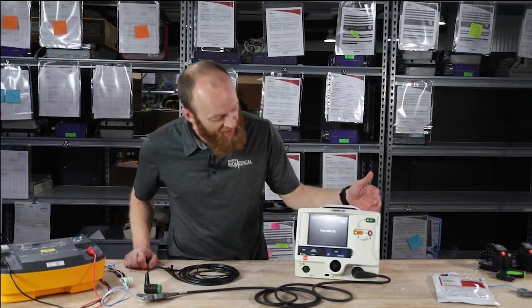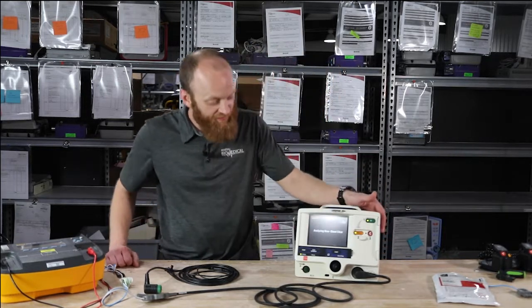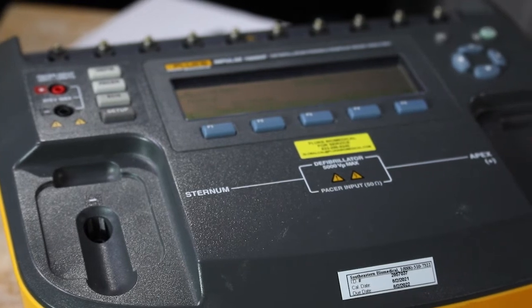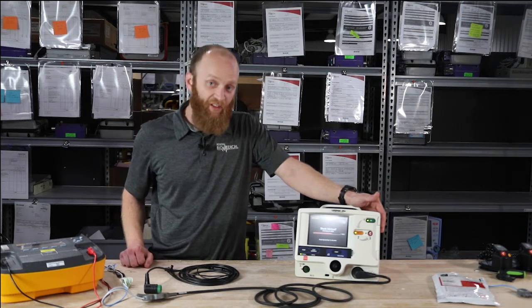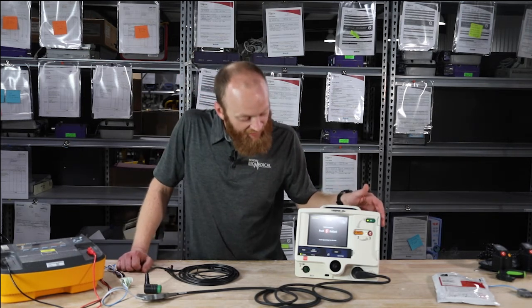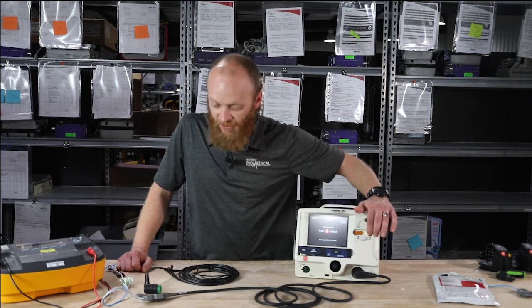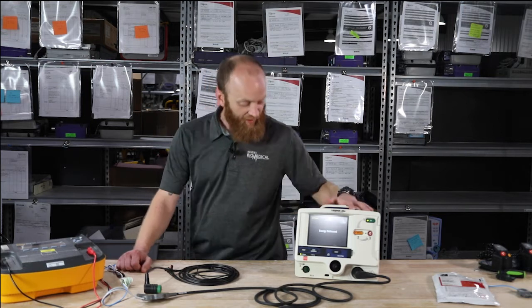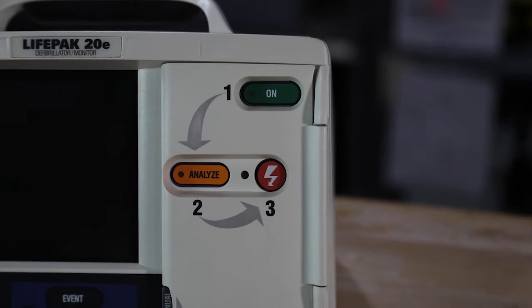At the end of the two minutes, it's asking me to push Analyze. We push Analyze — we now have the simulator in VFib. Shock advised. It recognized there was no R wave. Push to shock — charged. We push the shock button to deliver the energy, and it goes back into CPR.